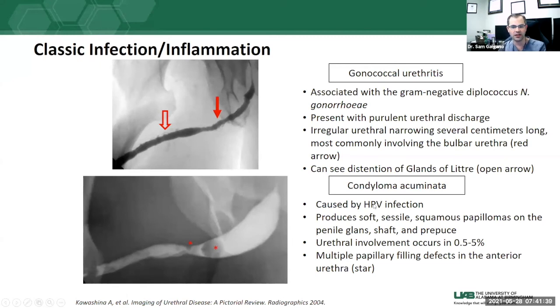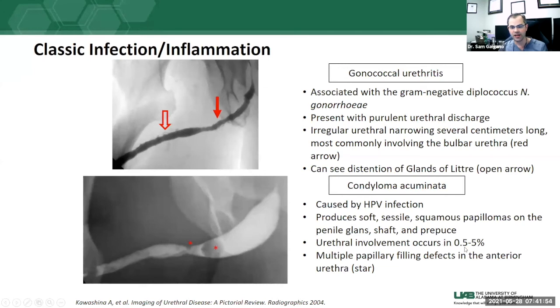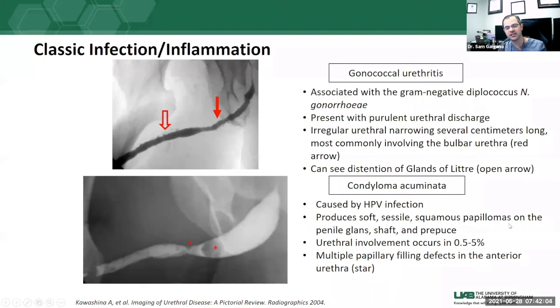Condylomas are HPV infections, similar to condylomas elsewhere in the body — soft, sessile squamous papillomas occurring on the penile glans, penile shaft, and prepuce. Urethral involvement is fairly rare, ranging from 0.5% to 5%. What you can see on urethrography is multiple papillary filling defects within the urethral lumen — it looks just as you'd imagine a papilloma to look, but rarely affecting the inside of the urethra.